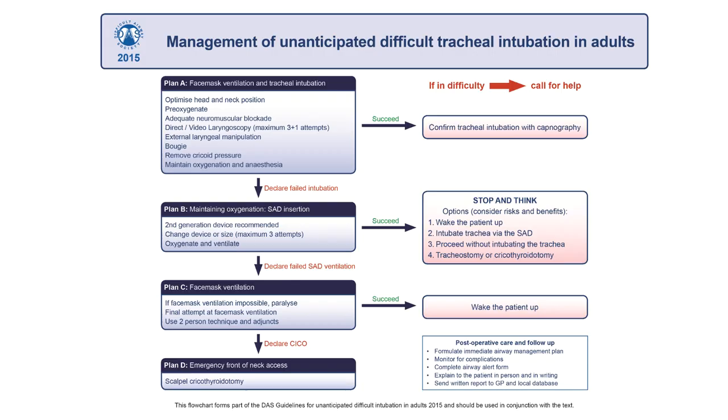I will demonstrate the scalpel cricothyroidotomy technique described in the 2015 Difficult Airway Society guidelines. It can be summarized as: stab, twist, bougie, tube.